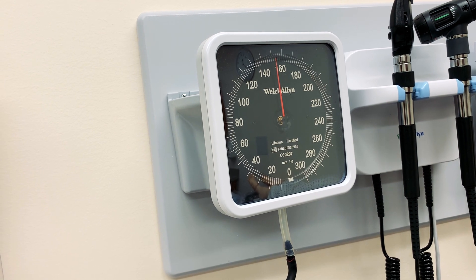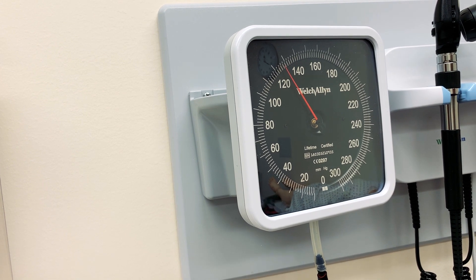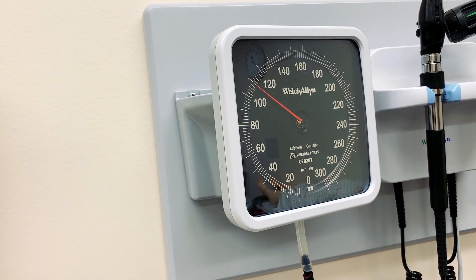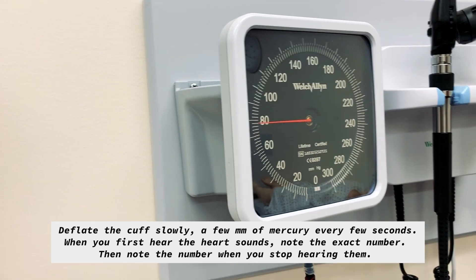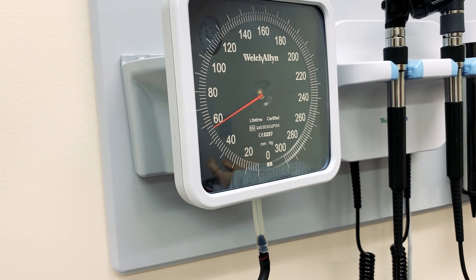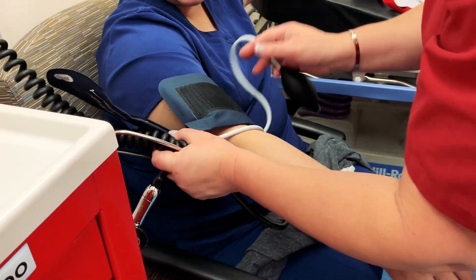See what happens when you open it too much — it goes too fast. You want to let it out about five millimeters of mercury every couple of seconds. Once you have your diastolic number, you can go ahead and let the rest of the air out. Her blood pressure ended up being about 110 over 80, which is really good — and that's her normal.